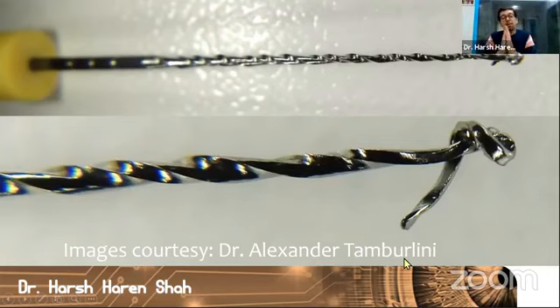I would surely say this is a major, massive advantage, because if this did not happen, if this file did not wind upon itself, the second scenario possible would be this file would have separated in the canal. So if you've not prepared your 10 number K file till the apex properly, please remember, do not use any rotary files. If you're lucky and if you're using 1G, your rotary file will just get twisted like this and there will be no harm.